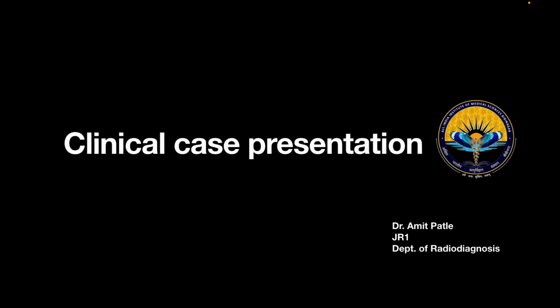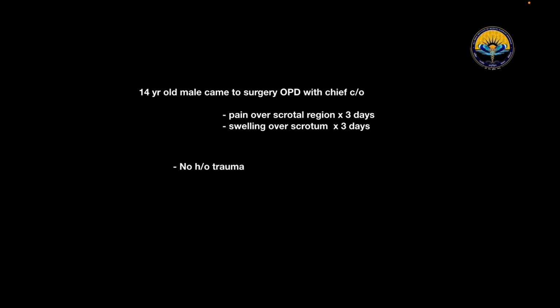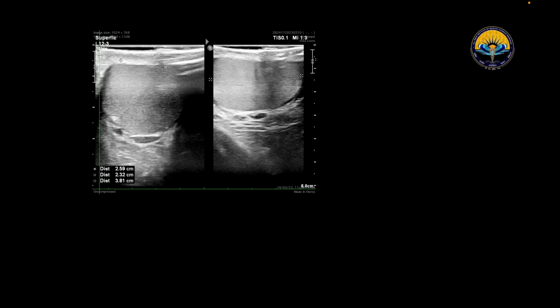A 14-year-old male came to surgery OPD with chief complaints of pain over the scrotal region and swelling over the scrotum since 3 days. There is no history of trauma. The patient was then referred by the surgery department to the radiodiagnosis department for ultrasonography.